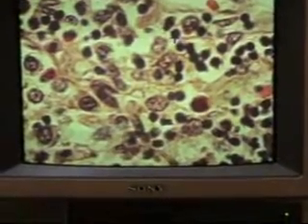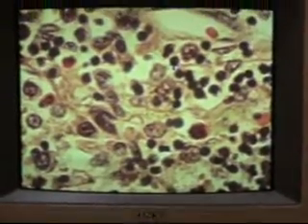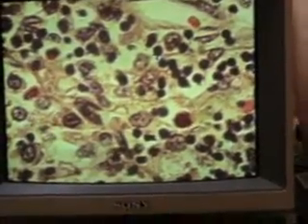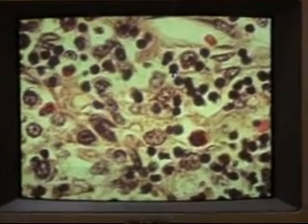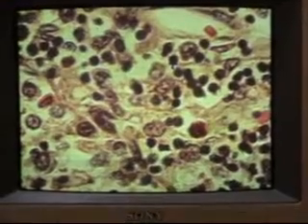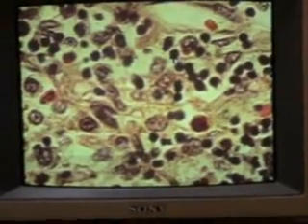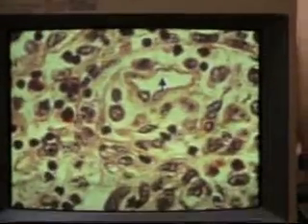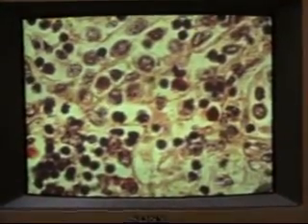It was only recently, when these thymic nurse cells could be cultured in vitro, that scientists could show that they are able to engulf lymphocytes and have them inside the cytoplasm. So they really nurse them inside the cytoplasm. Blood vessels. So these are the most important things about the thymus.